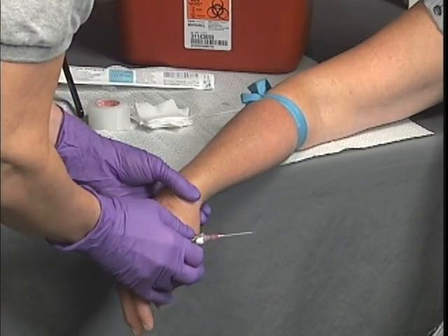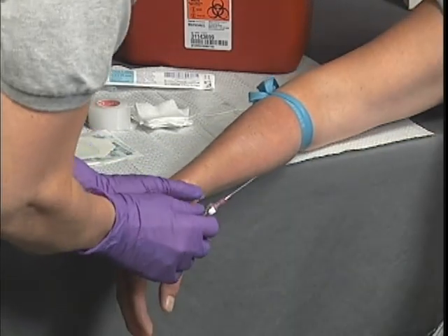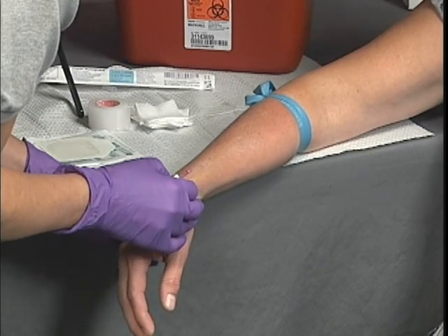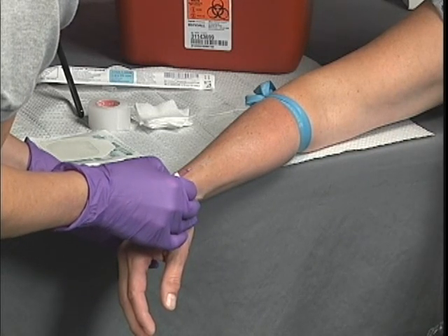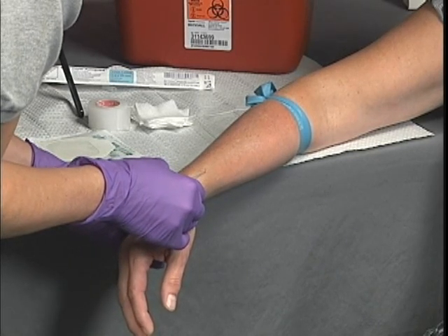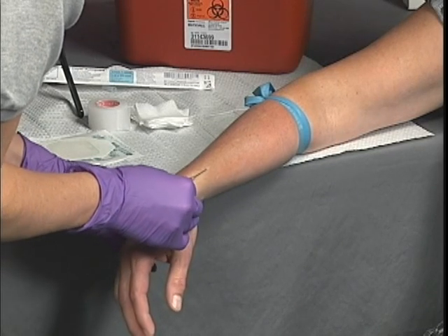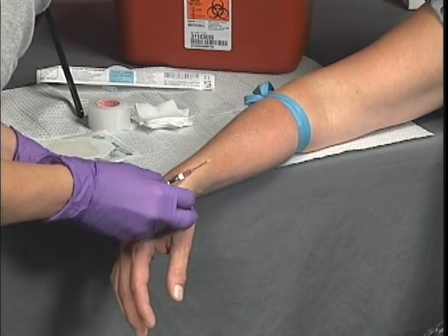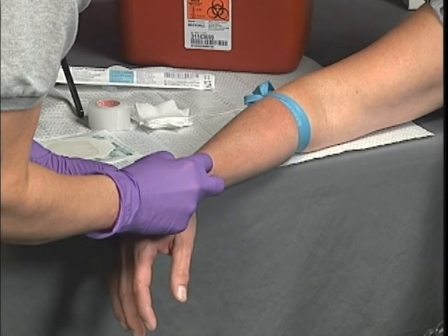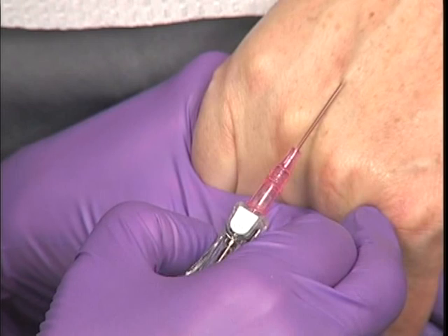Grasp the patient's extremity near the IV site using your non-dominant hand to stabilize the vein. This may be accomplished by pulling traction distally or holding the extremity circumferentially so the area is taut. Ensure that the bevel of the needle is facing upward in relation to the patient's skin. While continuing to apply traction to the skin, quickly but carefully enter the skin with the needle. A pop may be felt as the needle enters the vein. In the flash chamber, you will see blood when the needle enters the vein.